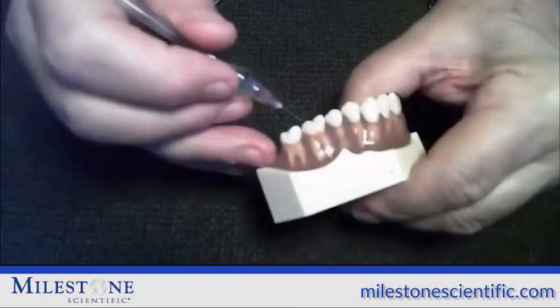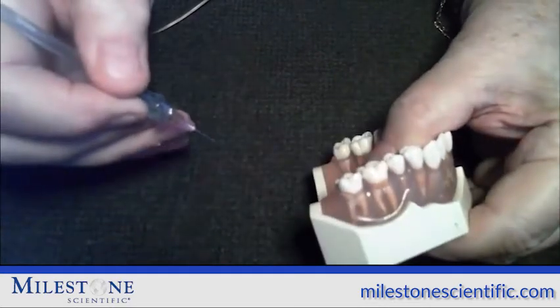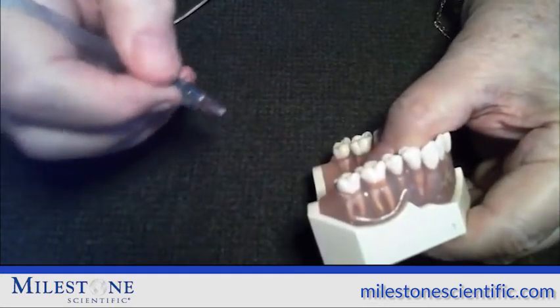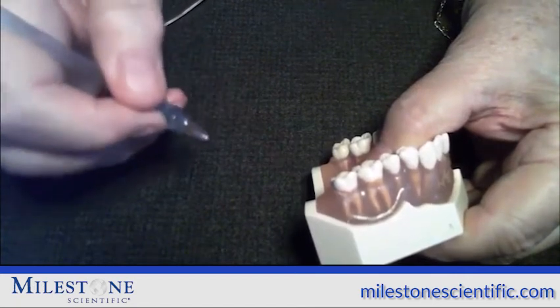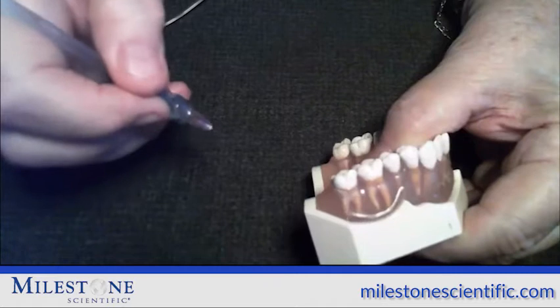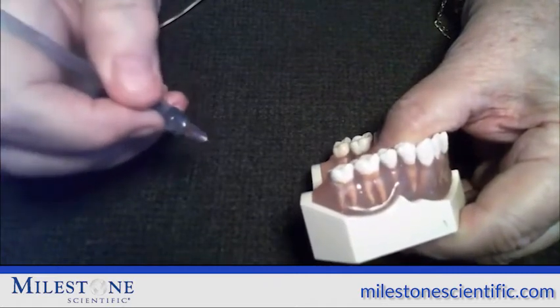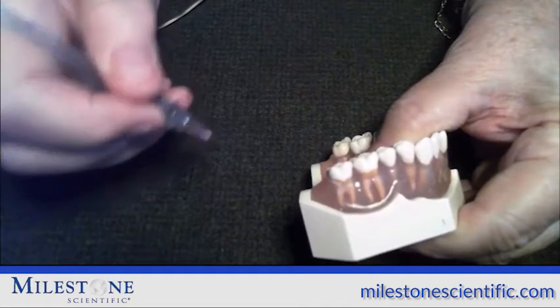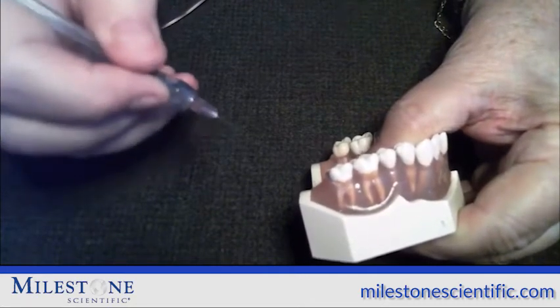But if you take that needle out during aspiration, and when aspiration finishes, you see 10, 20 drops, a steady stream of anesthetic coming out of that needle, then that anesthetic did not make it into the bone, and you're probably not going to get sufficient anesthesia, at least for the duration that we would expect, which is approximately 1 hour of profound anesthesia on the tooth and on the tissue.